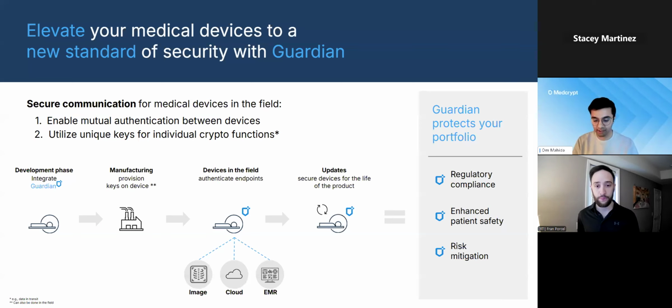Yeah, that's a great point, because security also unlocks a lot of features and capabilities some people don't think about right away. One of the things we've really seen shift in medical devices is that as they become more connected, the ask from a business perspective is, hey, can we add functionality later? And so now remote updates come into play.